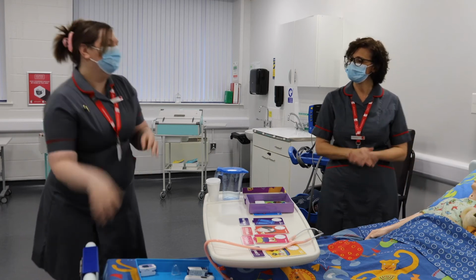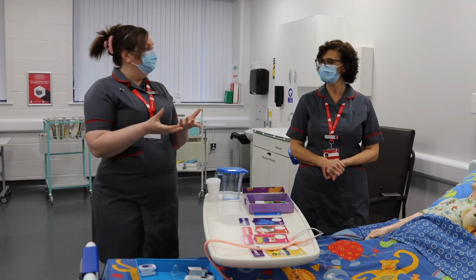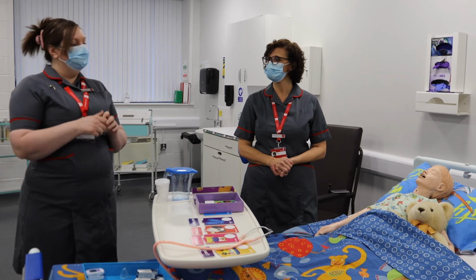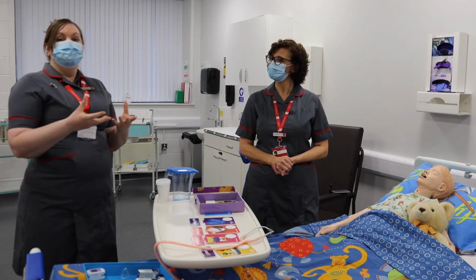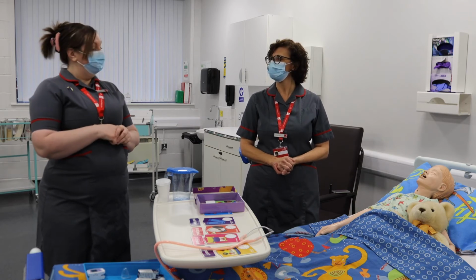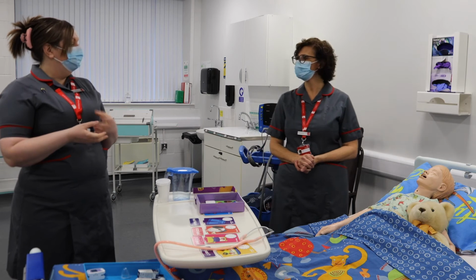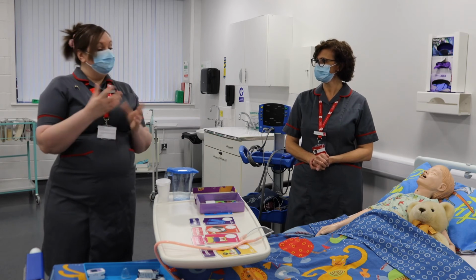So the way that we would use a mannequin such as Sam is that we'd probably have a theory session first where we'd understand perhaps some of the anatomy and physiology. We'd look at what the normal parameters for the vital signs are. We'd understand why those vital signs were important to measure. And we'd talk through the process and we'd perhaps use some videos to really show how to take those vital signs. We'd then come into a skills lab like we are now, and our students would have the opportunity of practicing those skills with Sam at the bedside, but just focusing on the skill aspect.